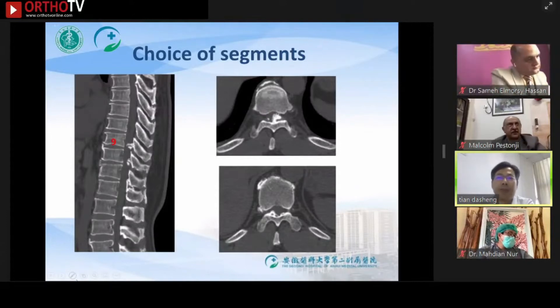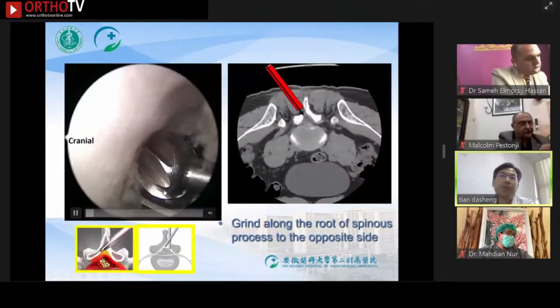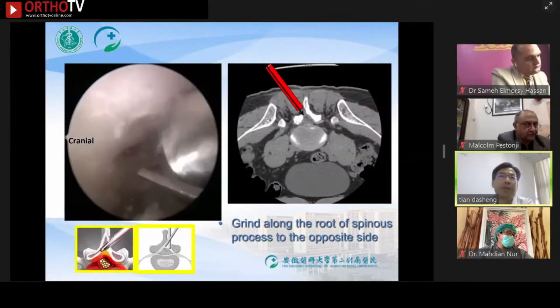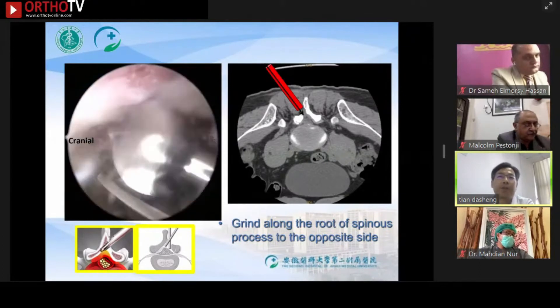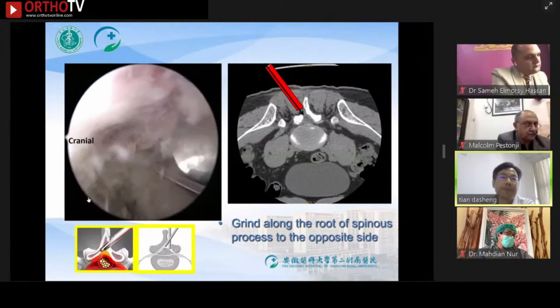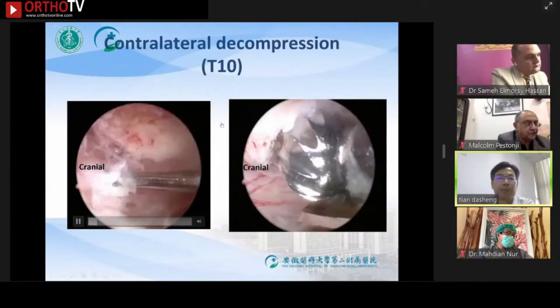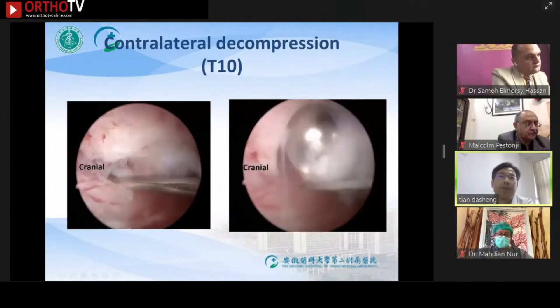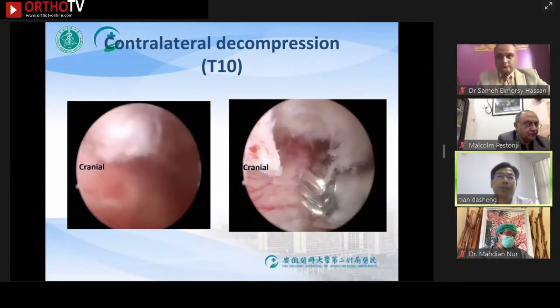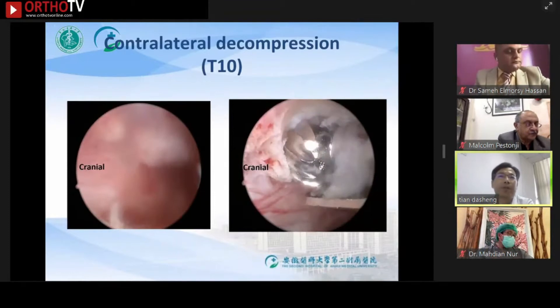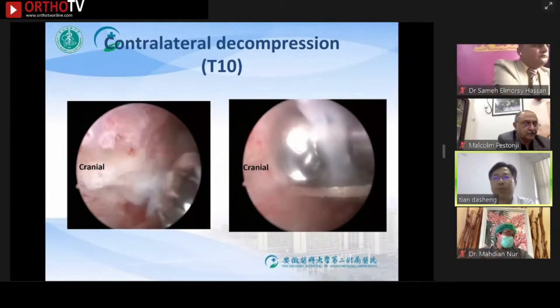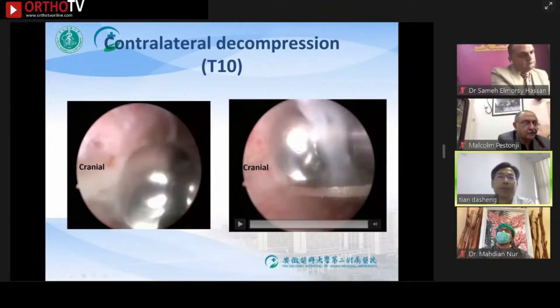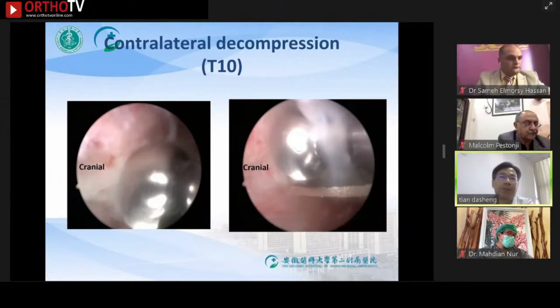We first addressed the segment with lighter compression to decompress. The video shows the beginning of the operation. The burr cuts the bone along the root of the spinous process to the opposite side, similar to ULBD surgery. For the T10 segment, we use the over-the-top decompression technique to reveal the full picture of the ossification, going from tail to head along the dura mater surface, removing the compression until there is no compression on the dura.